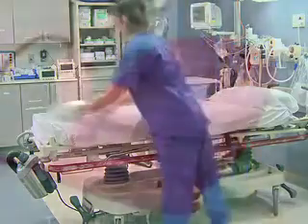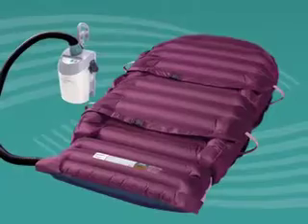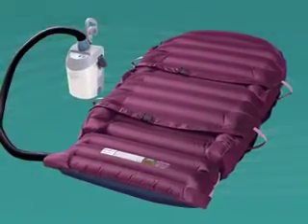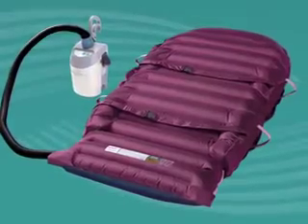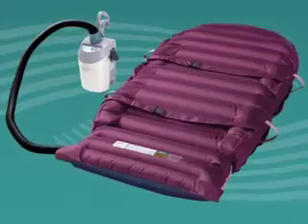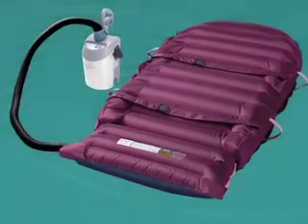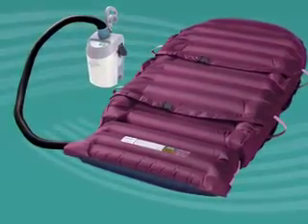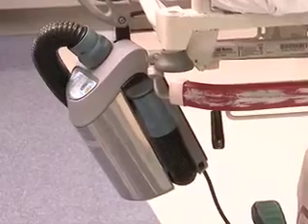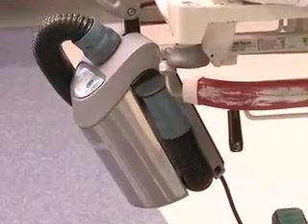Disinfect the HoverMatt transfer mattress and air supply between patient uses with whatever the facility uses for medical equipment disinfection. The transfer mattress can also be laundered. Refer to the HoverMatt User's Manual for detailed instructions before laundering the HoverMatt. The air supply should be hung off to one side at the end of the stretcher for immediate availability.